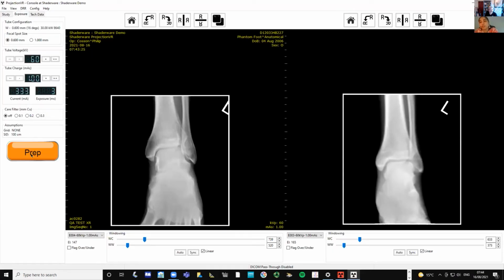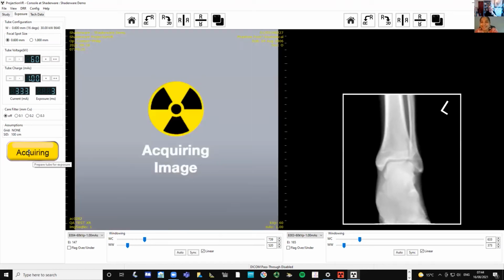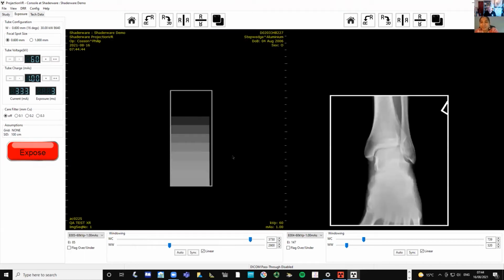Well, have you computed the difference? I mean, we'd hope there isn't much difference, because we've spent years and years developing this so that it mimics entirely the real X-ray machine. So although there may be slight differences, there should be no differences in trends. When ours goes up, the real one goes up, and when ours goes down, the real one goes down. So it's valid. Our system is valid. There'll always be a difference between two X-ray machines.